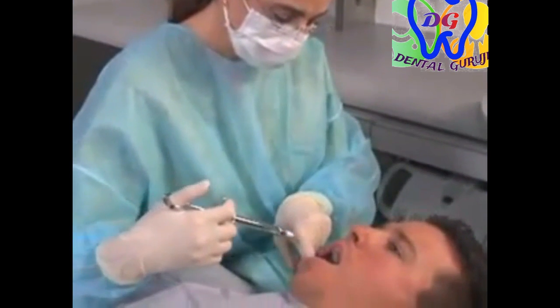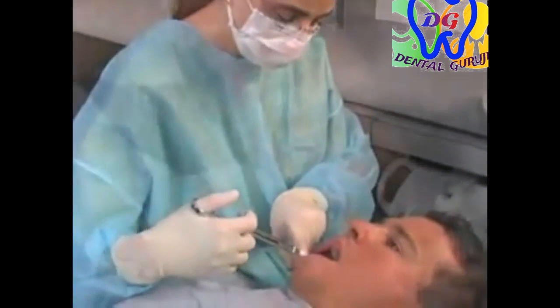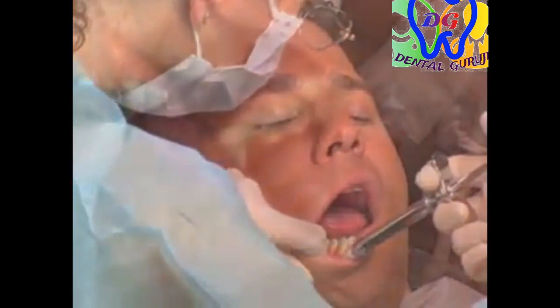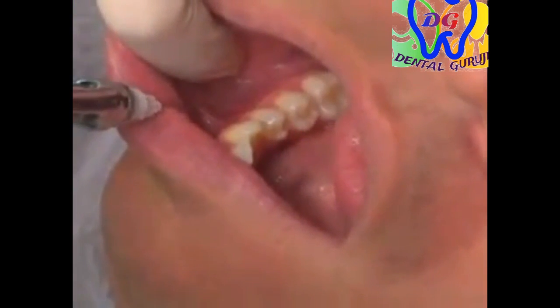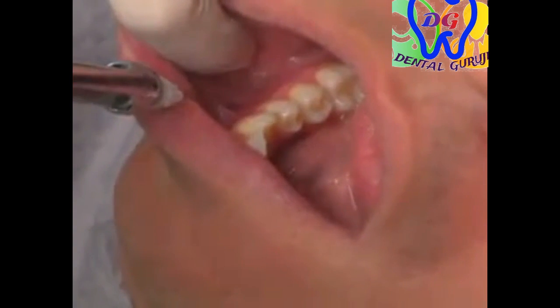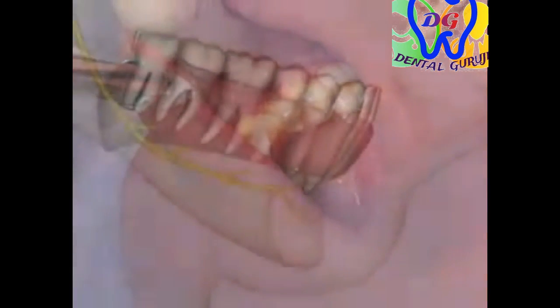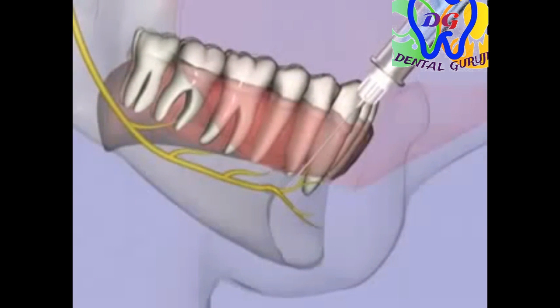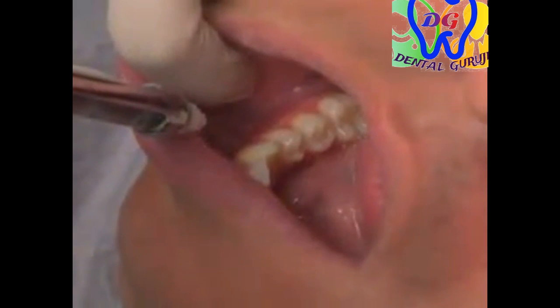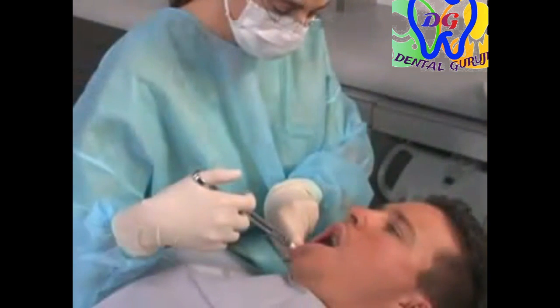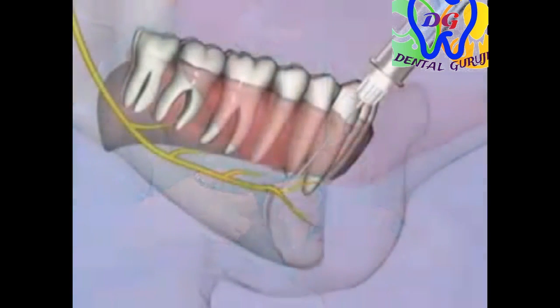For the right or left incisive nerve block, the barrel of the syringe is kept below the patient's line of sight, and the needle inserted into the buccal fold adjacent to the first premolar, then advanced until the needle tip lies outside the mental foramen. Following two negative aspirations, one-third of a cartridge of anesthetic is deposited over 20 seconds.